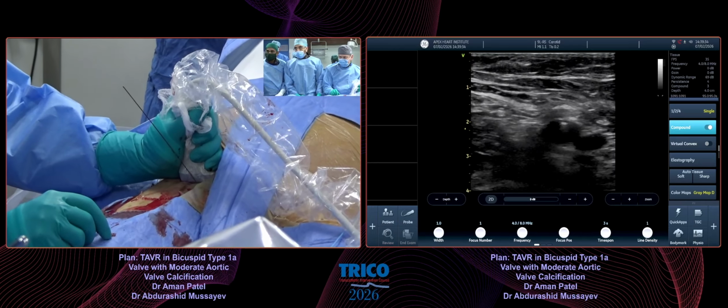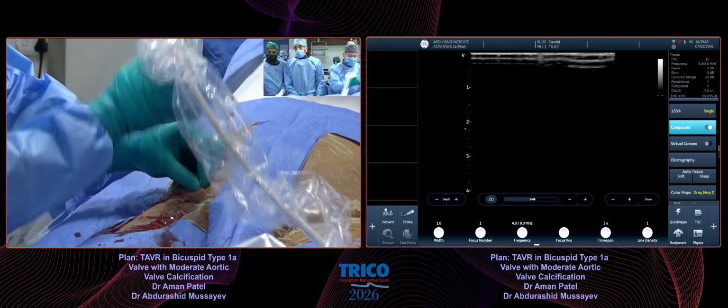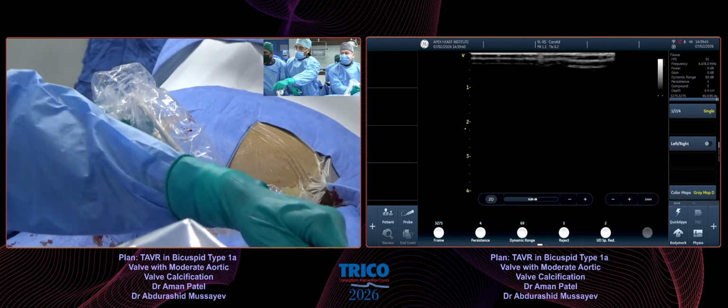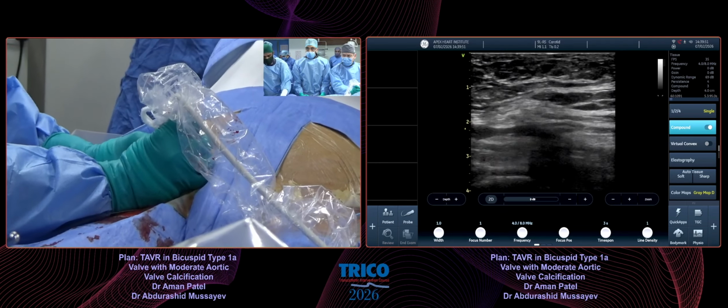Look, it is punctured anterior wall. Yes, 12 o'clock position, yes. Yes, and in long axis, freeze please. 2D. Also, this confirms the common femoral access. And as Professor said, there is an institutional protocol.